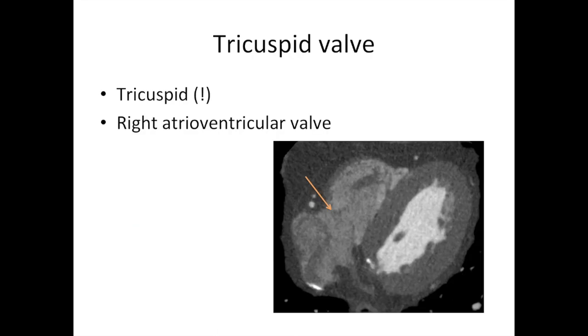Let's start with the tricuspid valve. This is between the right atrium and ventricle. It's aptly named because it has three cusps, and you can see it here with the orange arrow and the blue lines on this CT scan.